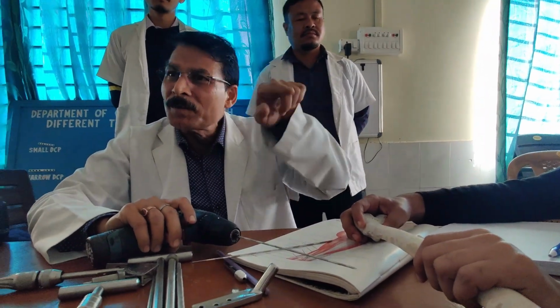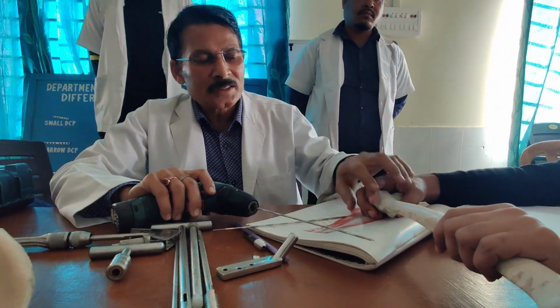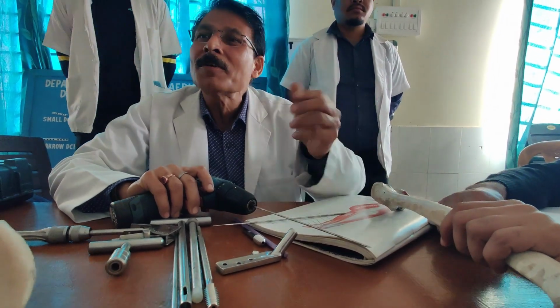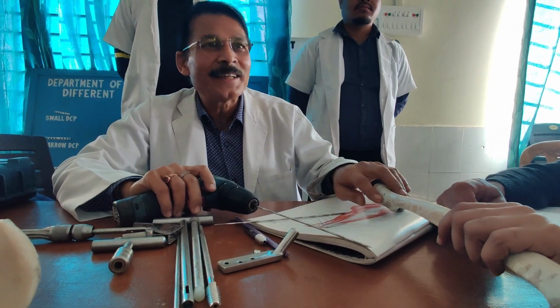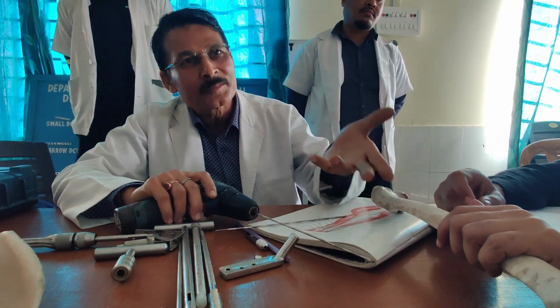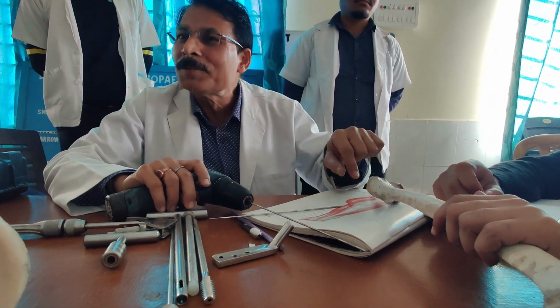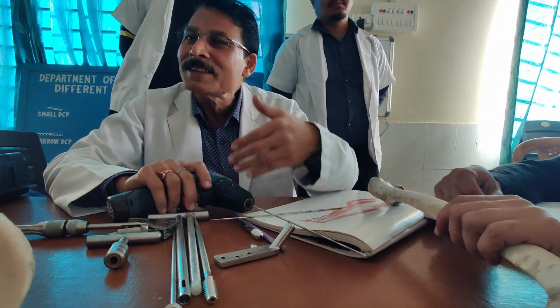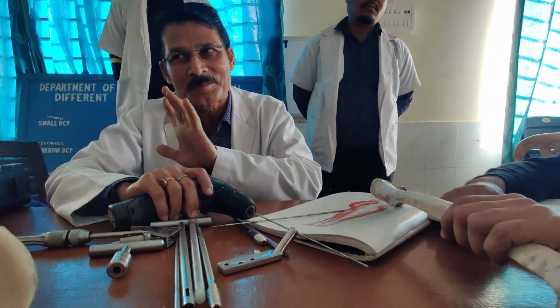Invariably you will find it may deflect to some extent, so it will be difficult to maintain. So initially start it. If the hole is big, there is nothing to worry about, because you are going to make the hole bigger later on. Even if you need to move upward and downward, it hardly matters, because you are essentially going to make the hole bigger to accommodate the plate later on. Yes or no? Yes, sir.